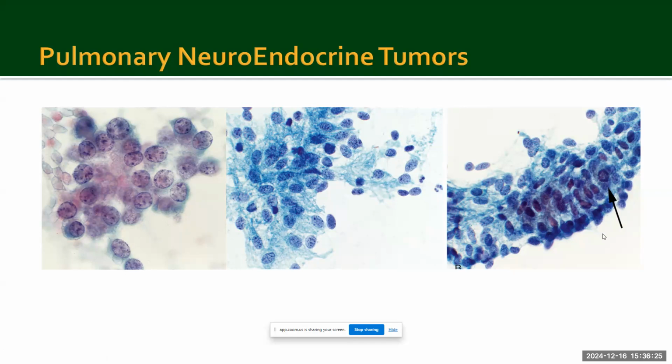I like to use the term carcinoid NOS and put everything in the comment, like the immunohistochemical stains which support the diagnosis of neuroendocrine tumor, whether there is mitosis or not, whether there is necrosis or not, and what the provisional grade is. But I make sure to include a sentence that definitive grading of these neuroendocrine tumors should be deferred to a resection specimen. That is my standard statement that I like to use.